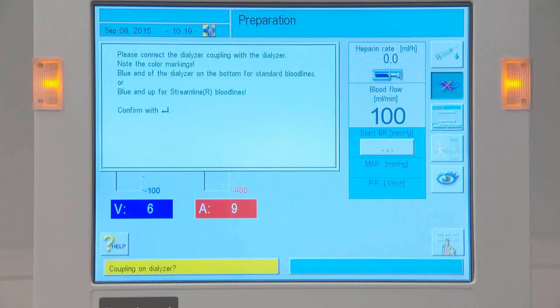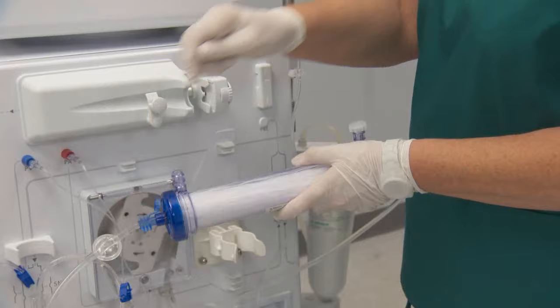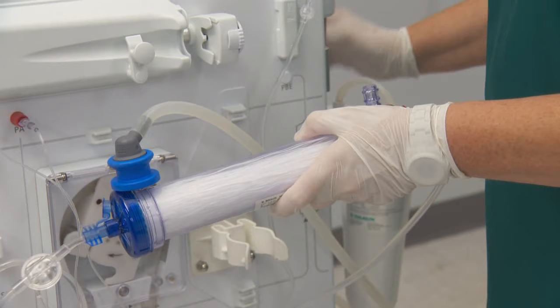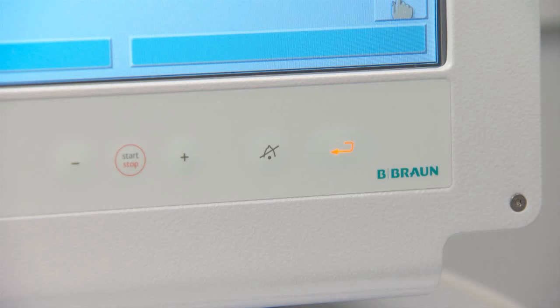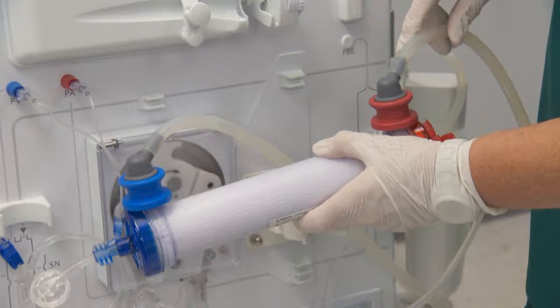You will be directed to connect the dialyser couplings once the self-tests are successfully completed. Remove the dialyser from its holder and tip the dialyser venous end down. Connect the dialyser couplings. Press the Enter key to begin priming the dialysate compartment. Once the dialyser has been primed, return the dialyser to the holder.